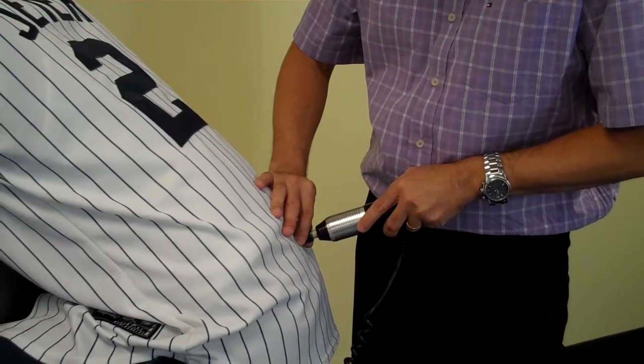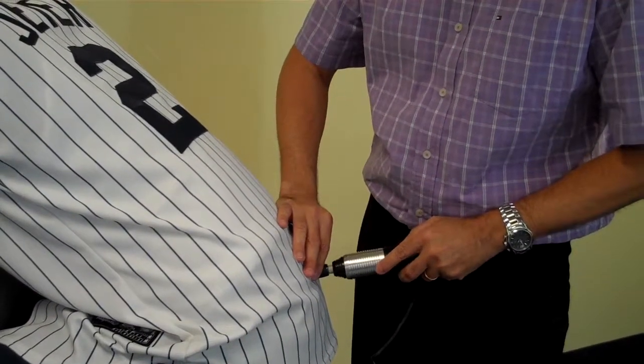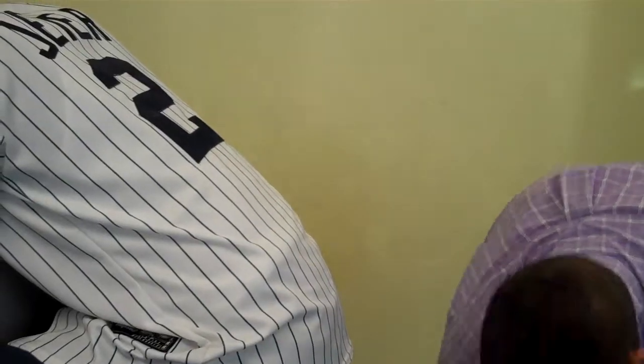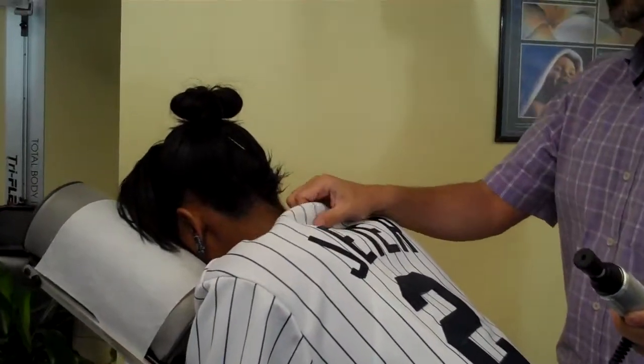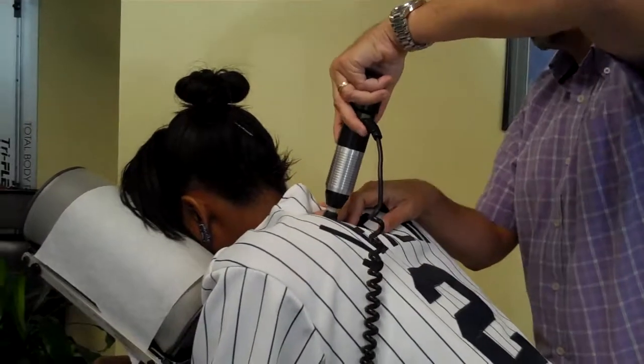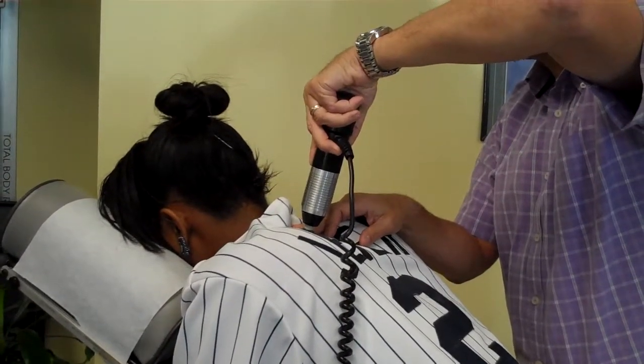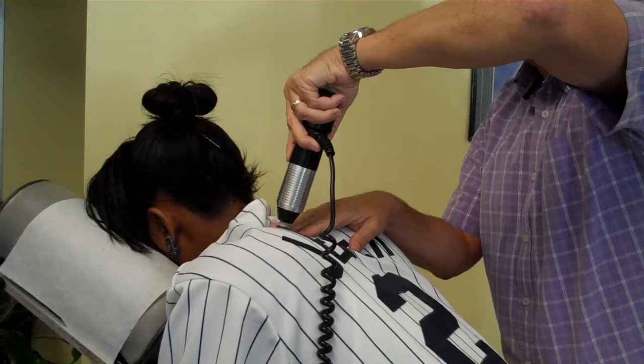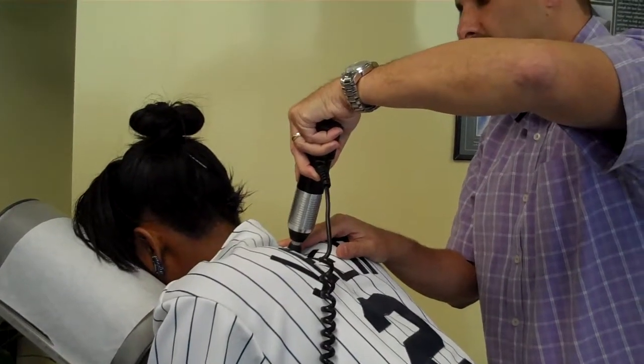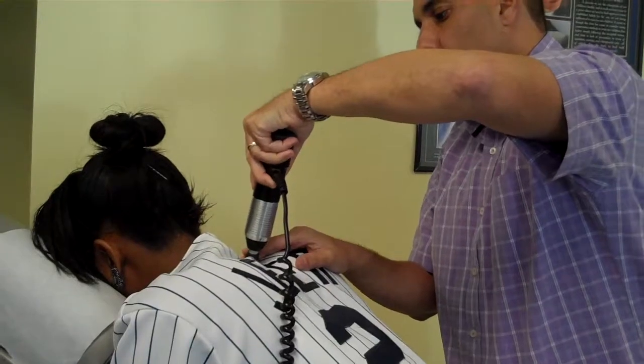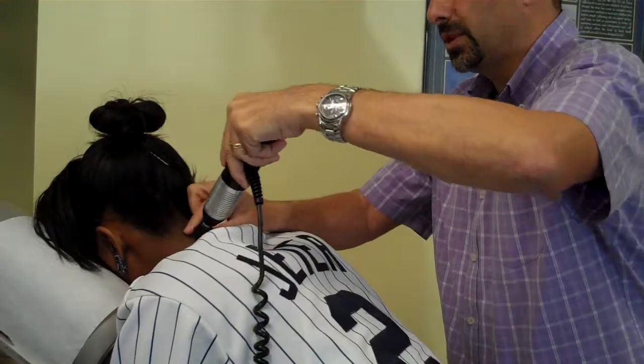Now you don't have to do this, especially if it's the patient's first adjustment. Because if you do this on their first adjustment, you may overstimulate the area and cause some extra soreness. So you don't have to worry about the scans being picture perfect right out of the gate. That's for something as you go through care with patients. What we're looking for here right now is just simply some balance.